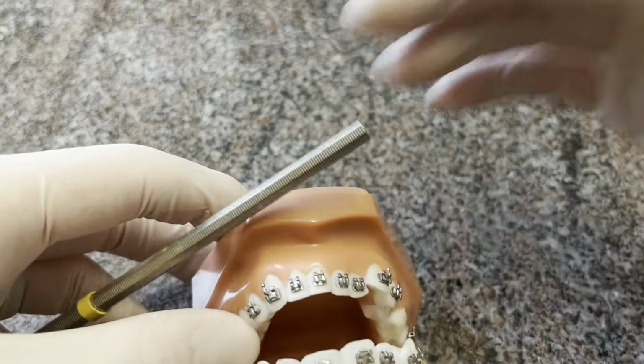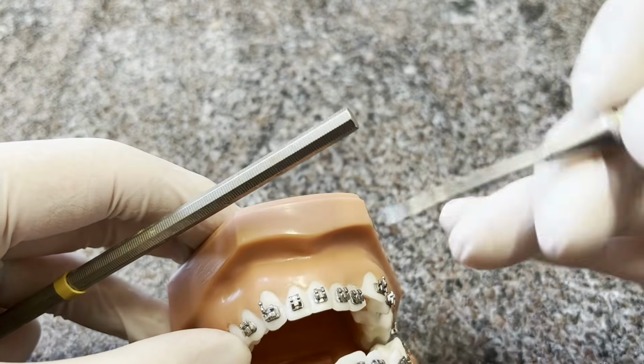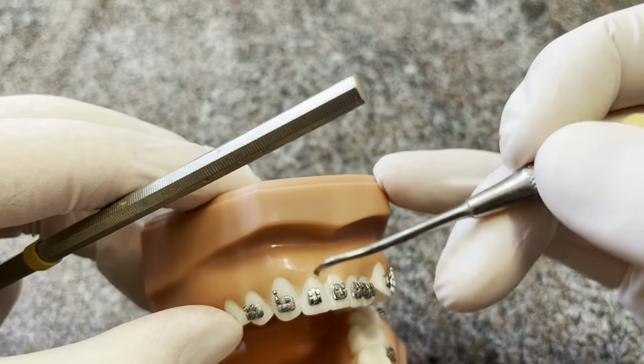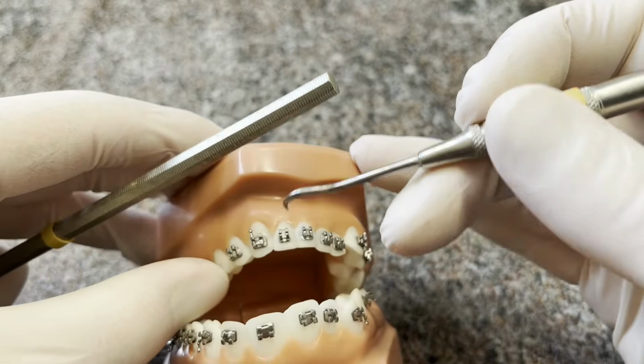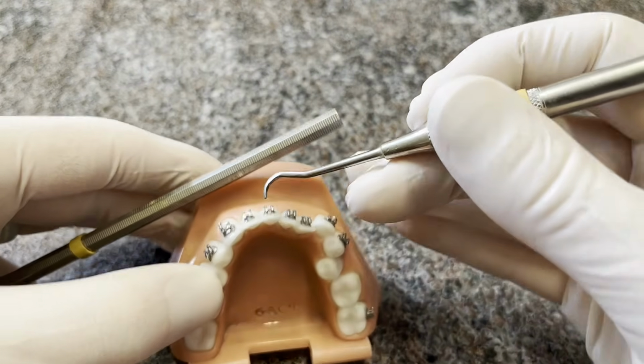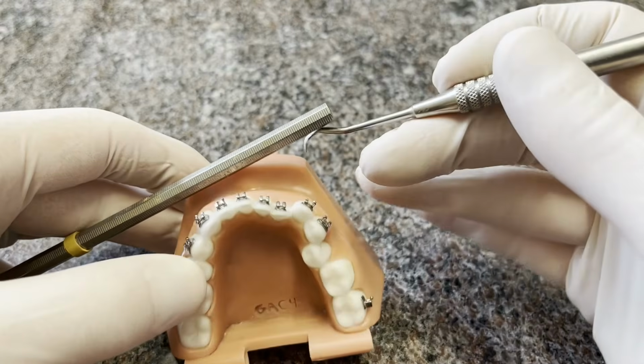You'll check tip by looking at the sides of the tooth and getting a sense for where the long axis of that tooth is. And then you go on to the next one. You do that with each of these, and so you'll position 3 to 3 usually for the doctor.